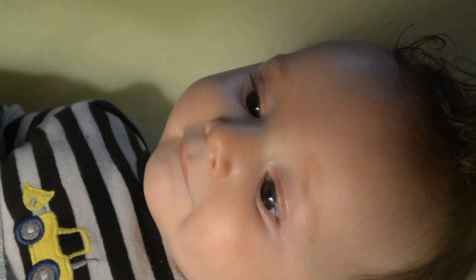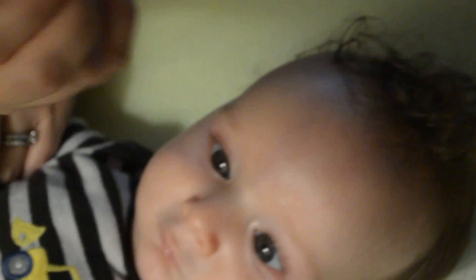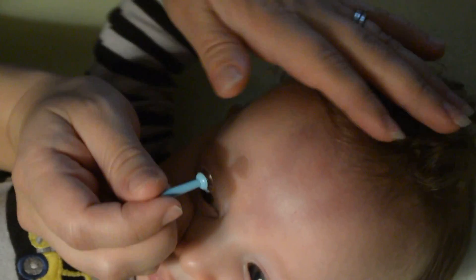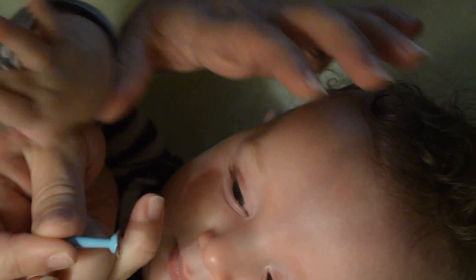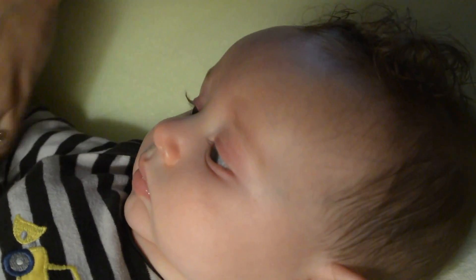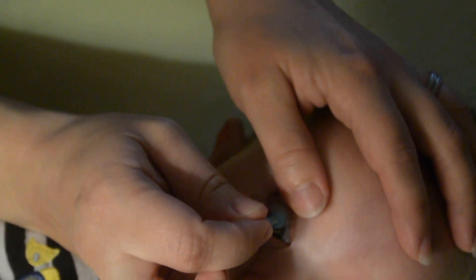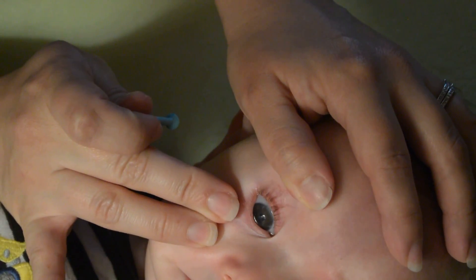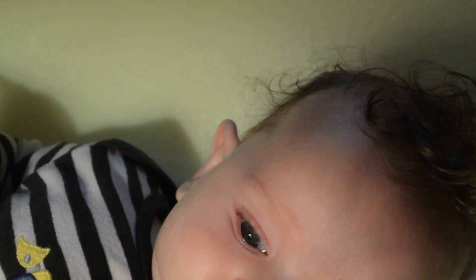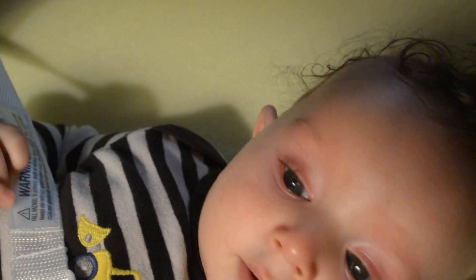With the hand that I am putting the contact lens in — the right hand — I am using the pinky to pull down on the eyelid. And then I am going to pull up on the top lid with the thumb of my left hand, and just pop it right on there. It is best if we go quickly. The lip of that was just up a bit, so I just pressed it and flattened it out. And it is now in his eye correctly. As you can see, he did not cry — he is happy as can be.